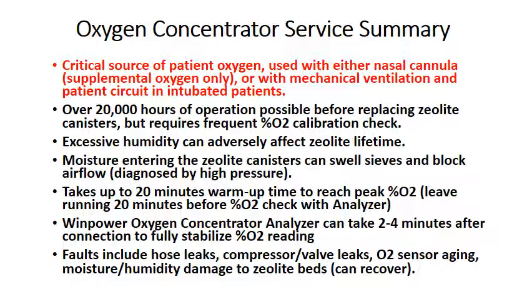So it can take up to 20 minutes of warm-up time to reach the peak oxygen saturation. So it's important when calibrating the units to wait an adequate length of time after turning on the concentrator. The faults that you can see include hose leaks, compressor and valve leaks, O2 sensor aging, because many of these do have O2 sensors integrated that will, for instance, turn off the unit ready light if the oxygen level drops too low. However, most oxygen sensors do have a lifetime, so that can be necessary to check.